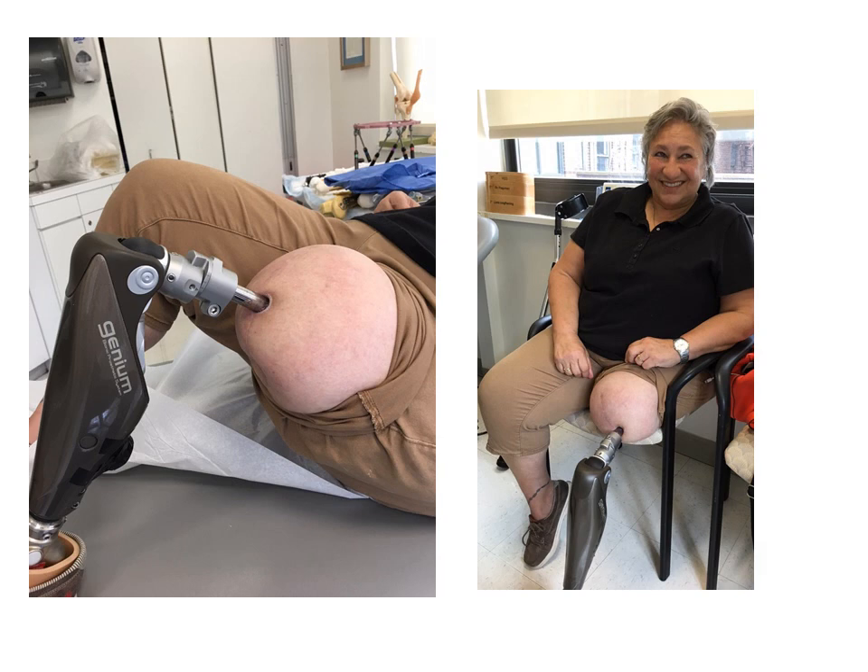Her stoma has been very easy to maintain. She has not had any infections of the stoma.